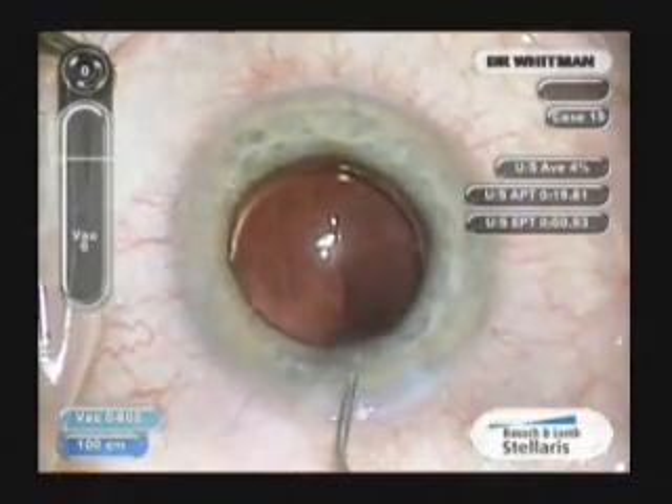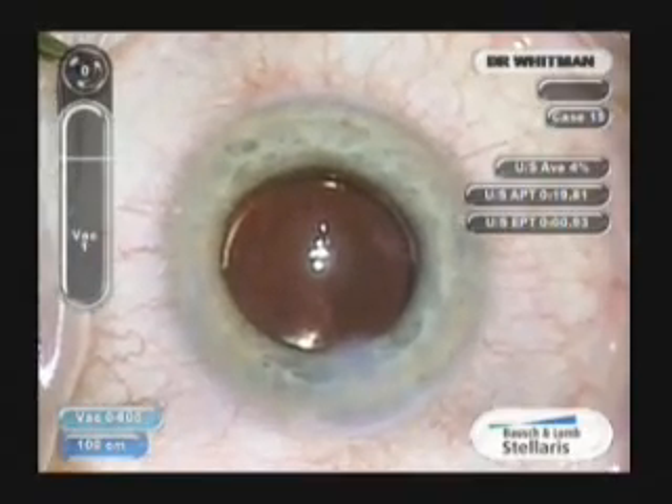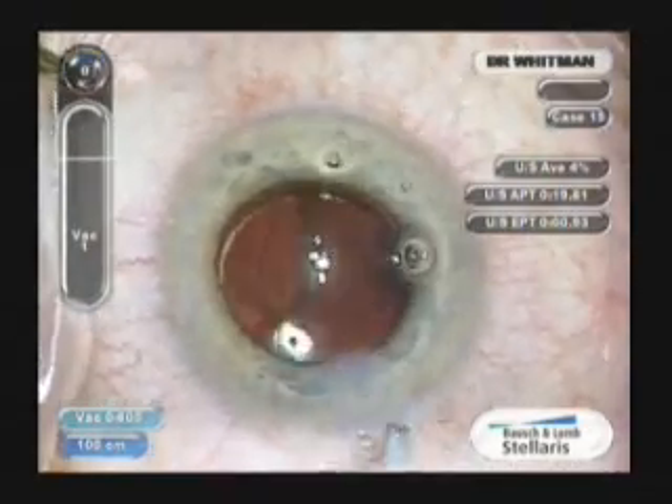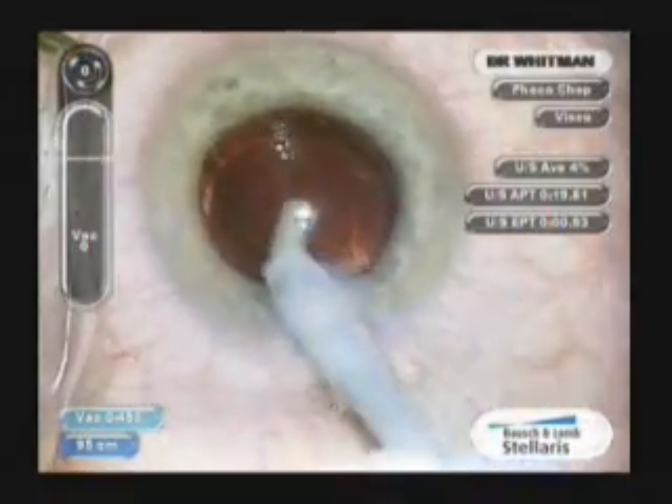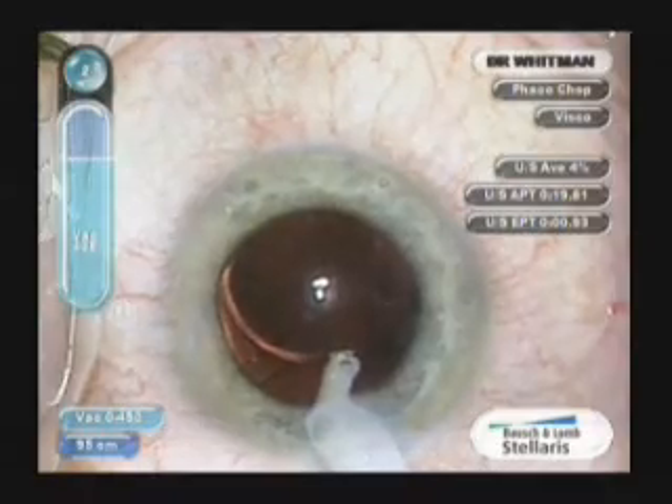When inserting the lens, you'll notice a little round hump on the right leading haptic and a similar hump on the left trailing haptic. This makes it easy to make sure the lens is always in the correct position.